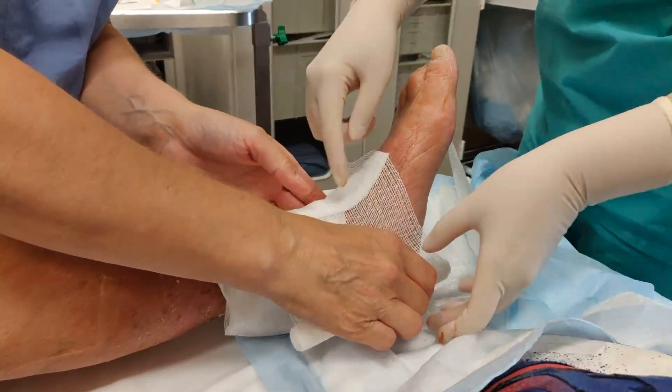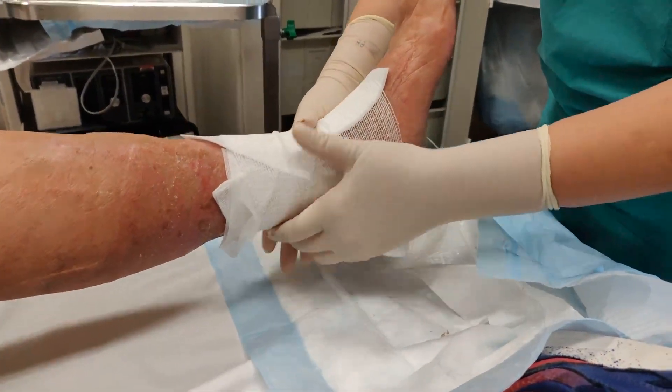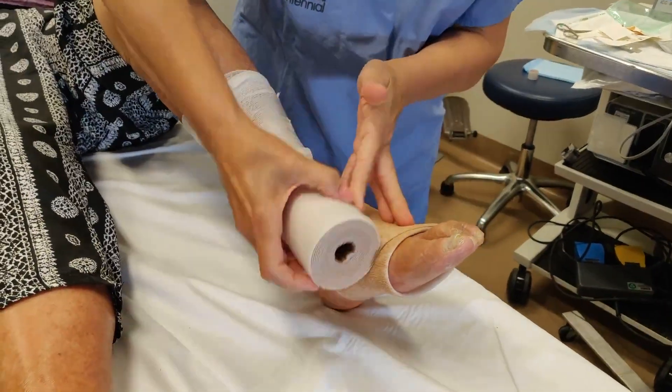After that, sterile gauze is applied to protect the affected area before the compression layers are applied. Finally, there are three bandage rolls used to wrap the wound.